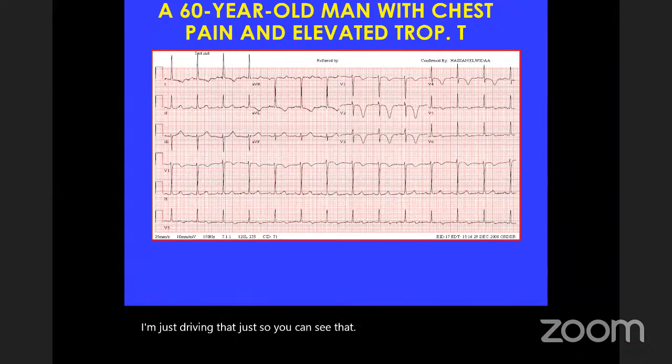So we can see the ECG. It is sinus, I can see P waves. The heart rate is regular, or maybe a little bit tachycardic, comparing the big squares: 1, 2, 3, 4. It's actually less than 100, so still within the normal range. Yes, from the mobile I just maximized it. I know it's not easy.